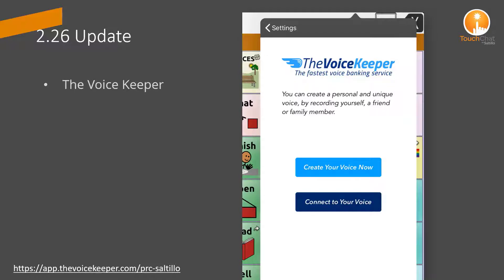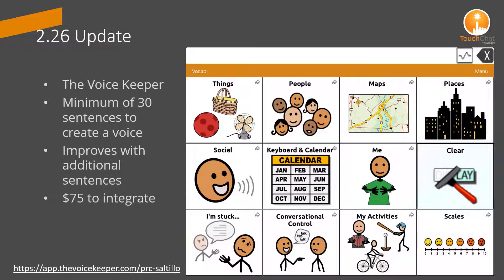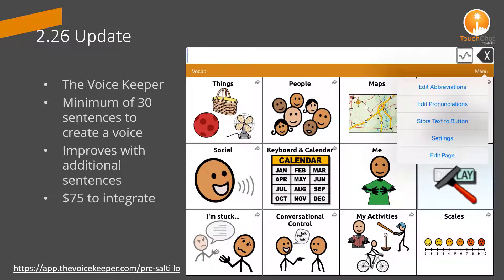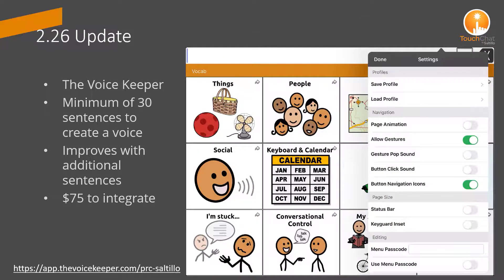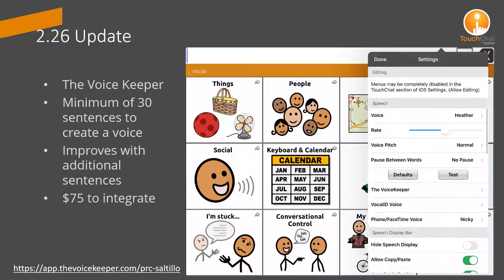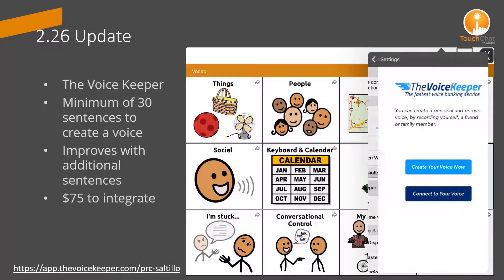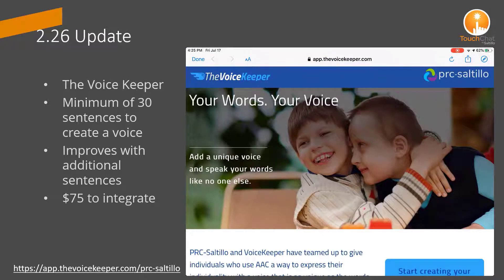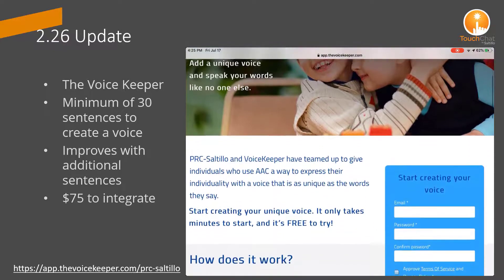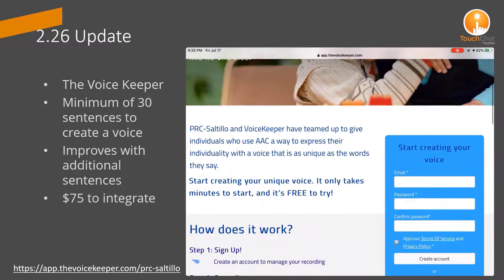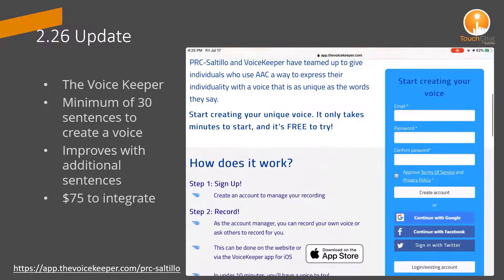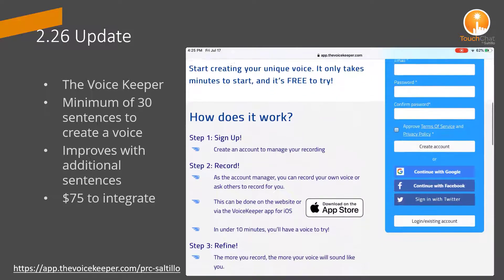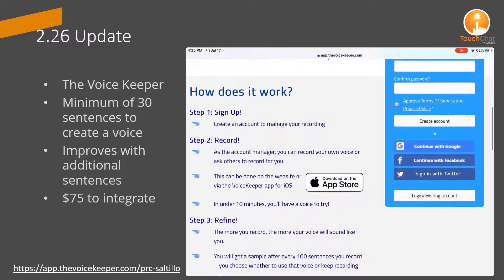PRC Sotillo has partnered with the Voice Keeper to provide integration of a custom voice within TouchChat. The Voice Keeper is easy to record and is connected within the TouchChat application. You can record using your iPad. The more recordings you provide, the better the voice will be. You can start with 30 sentences and then each additional 100 sentences the voice will improve. The fee is $75 to integrate into your TouchChat application.